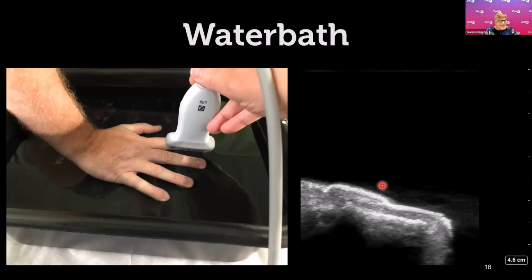But if they've cut their hand or their finger, it's easy for a patient to rest their hand in a plain bath of water. And it also helps to keep infection down as well. Now, the trick here is that you need a big plastic bowl, and it needs to be big enough so that the patient can immerse their hand or their foot into the bowl without it being at a funny angle and coming out of the water.